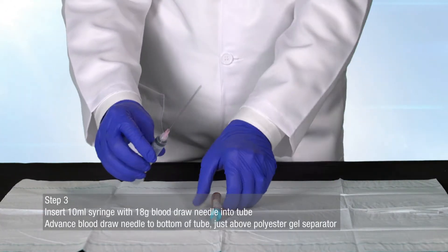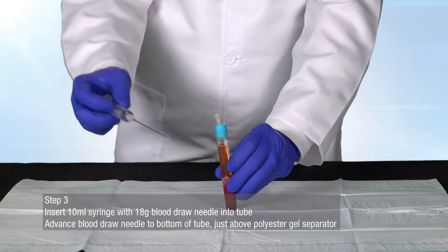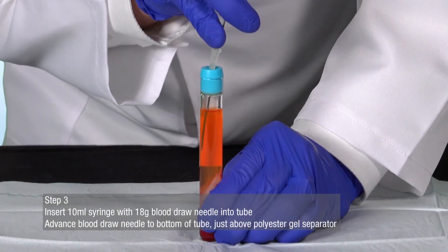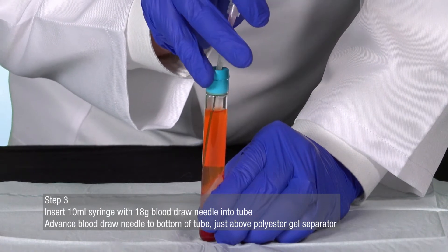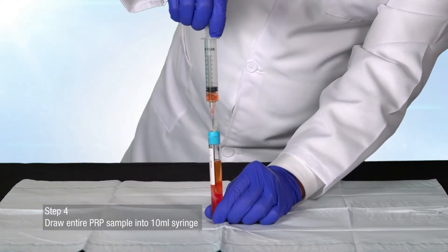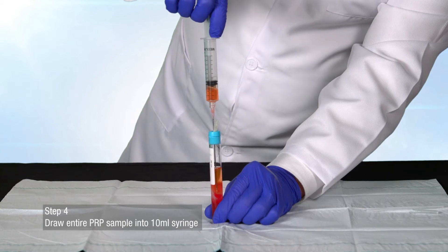Insert the 10 milliliter syringe with 18 gauge blood-drawn needle into the tube. Advance the blood-drawn needle to the bottom of the tube, just above the gel separator layer at its lowest point. Draw the entire PRP sample into the 10 milliliter syringe.